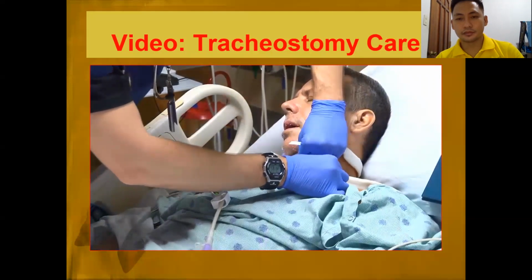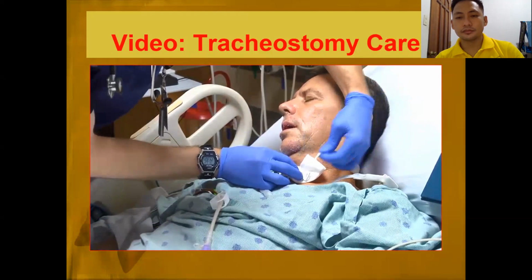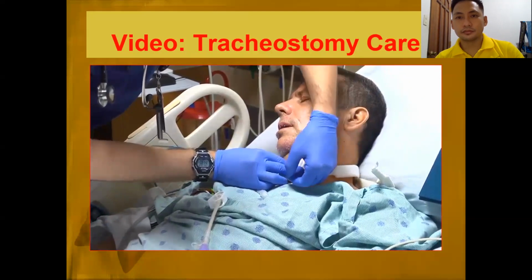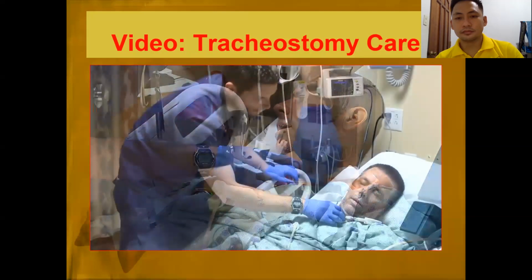Align the strap under the patient's neck. The Velcro attachments should be positioned on either side of the tracheostomy tube. Then place the narrow end of each tie under and through the eyelets on the faceplate and secure the Velcro closures. Feel okay?